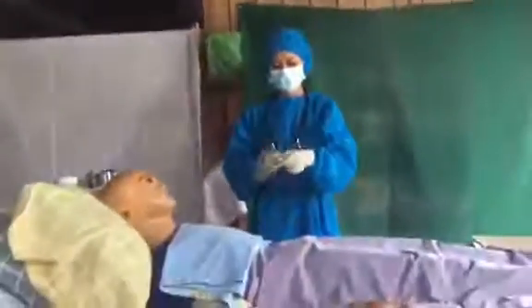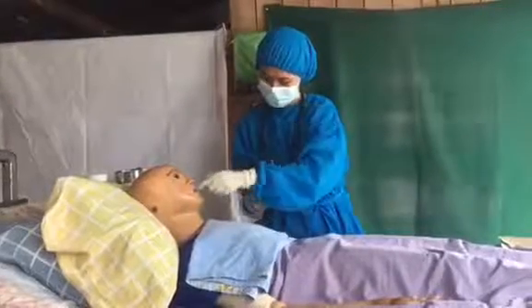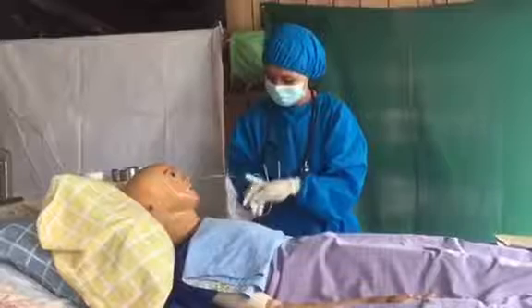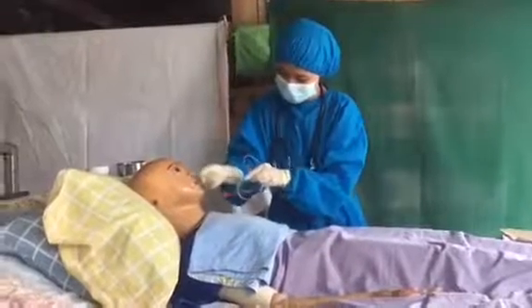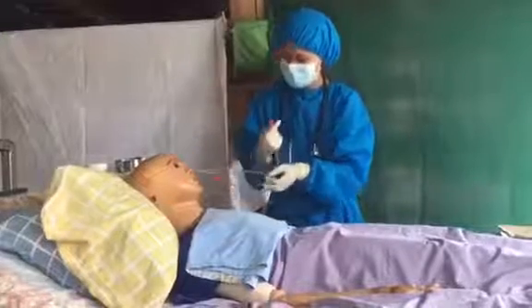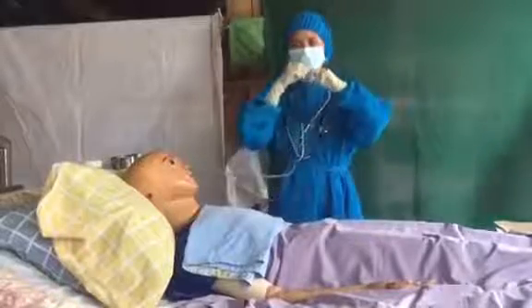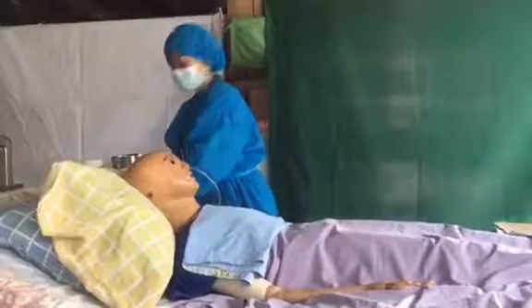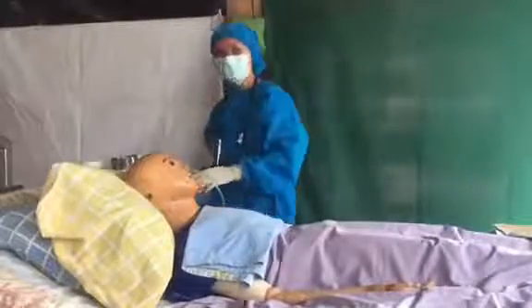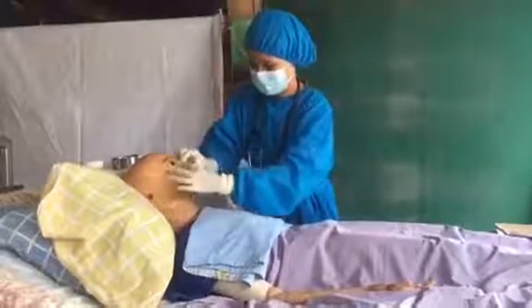Lubricate the tube 2 to 3 inches with KY jelly or water-based lubricant. Ma'am, I am going to insert now, and if you can feel that the tube is in your throat, kindly swallow. Then lock the tube to avoid entering unnecessary air. Secure the tube with a plaster or tape in the nose.